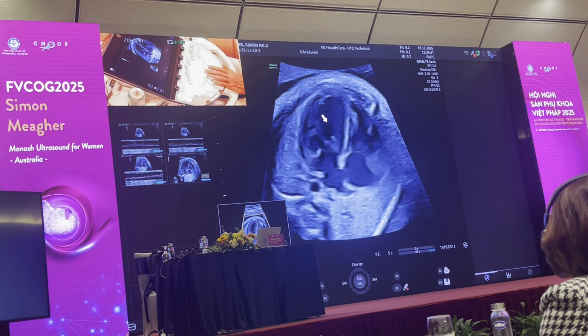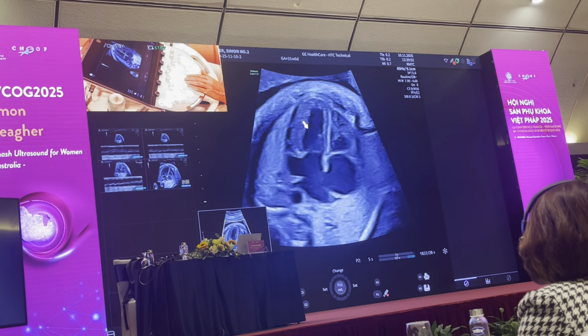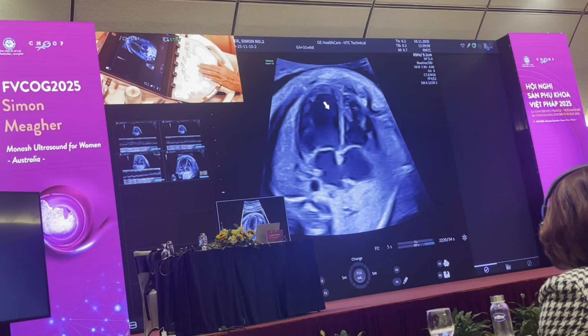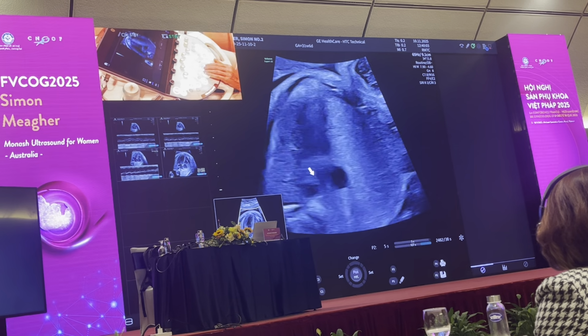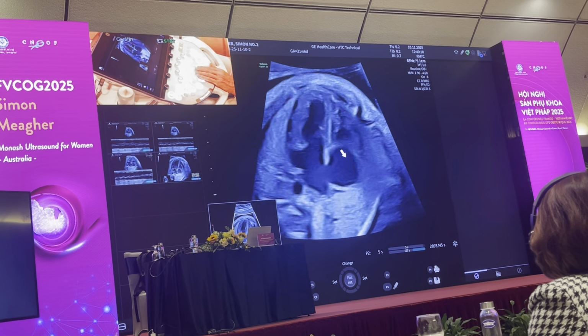You see the heart now is returning to moments of normal heart rhythm after block. So it's an intermittent rhythm. Babies with intermittent cardiac rhythm disturbances have a much better prognosis than those who are sustained. So if we look across here, this is the left descending aorta, pulmonary veins, left atrium, left ventricle, now back to normal heart rhythm, right ventricle and right atrium.